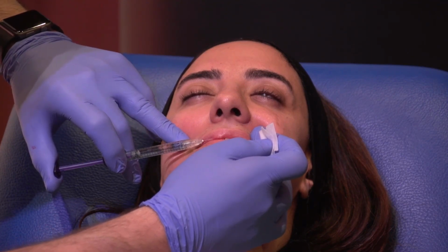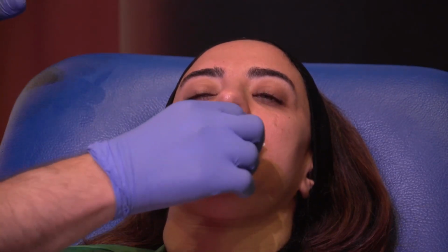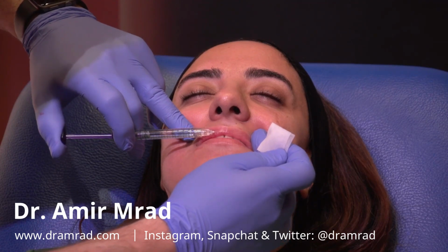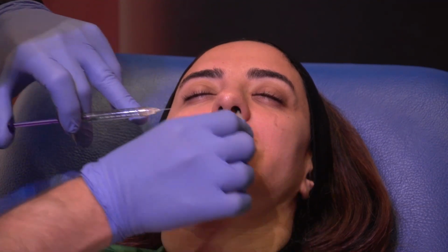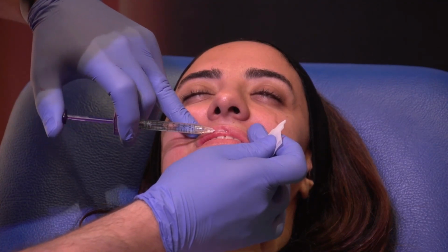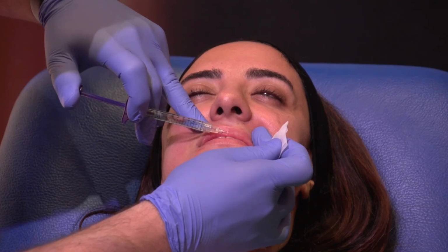Okay. Again, another 0.1 cc. I just press on the product a little bit just to make sure there is no accumulation of product on the lips. Okay. And then again, so this is, I think, the simplest, most satisfying technique for patients and doctors. I'm injecting as I'm pulling the needle out. Again, no lumps, just a linear thread. You can feel that thread when you're more lateral. See, pulling this lip and controlling the lip makes it less painful. Aspirate and then inject as you go.